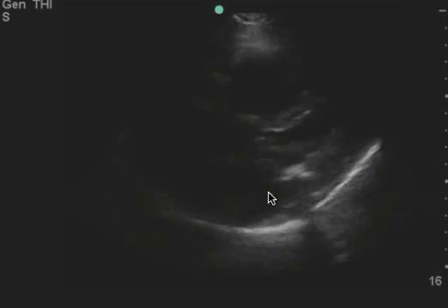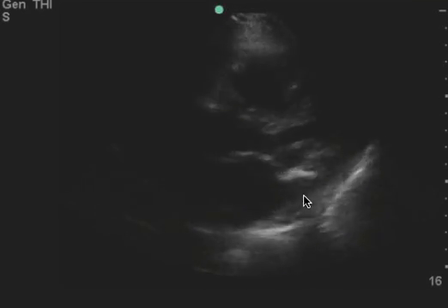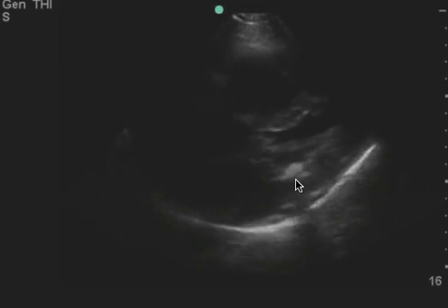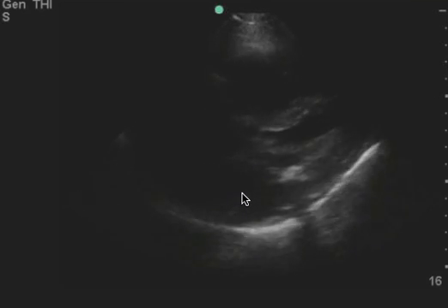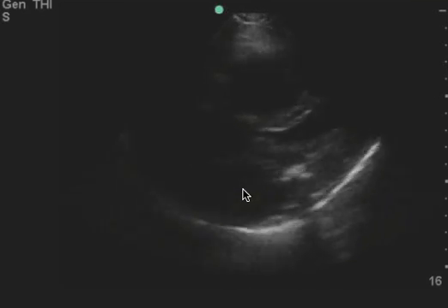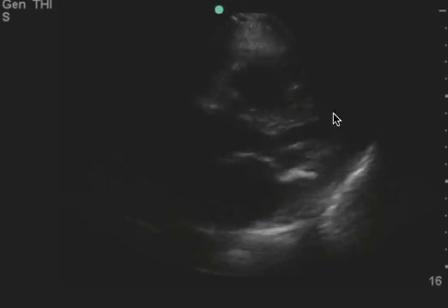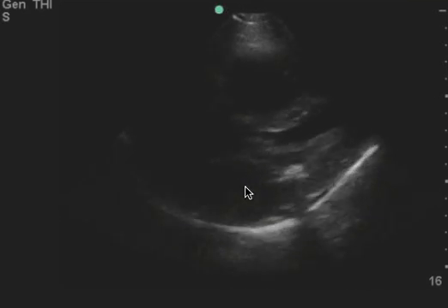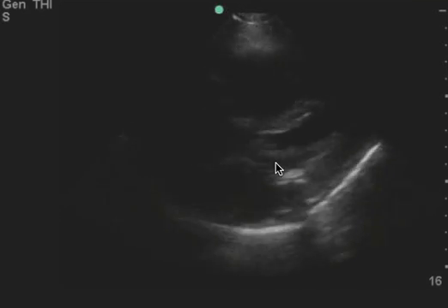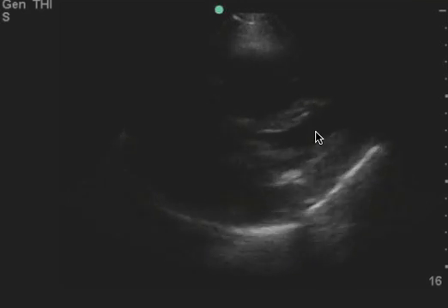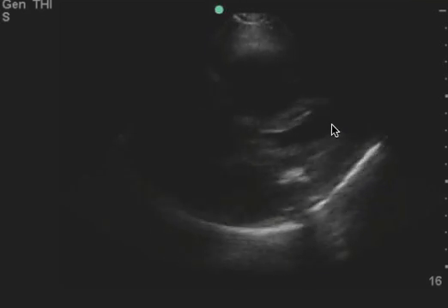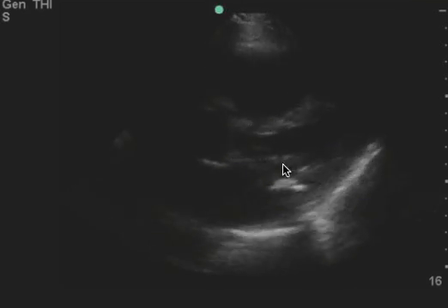I want you to focus on this area here. This is some calcification, which affects the transfer of blood from the left atrium into the left ventricle — either they're stenotic, meaning it's tough to get into the left ventricle, or there's regurgitation.